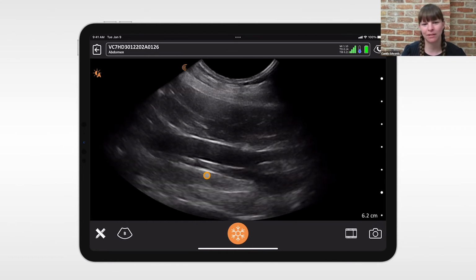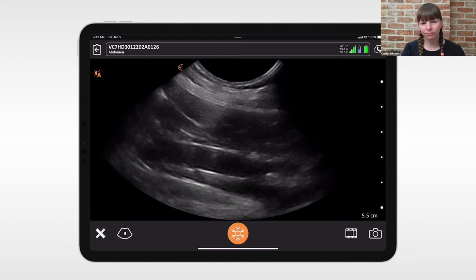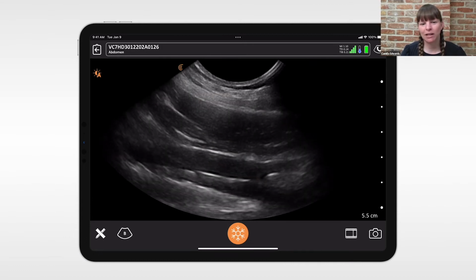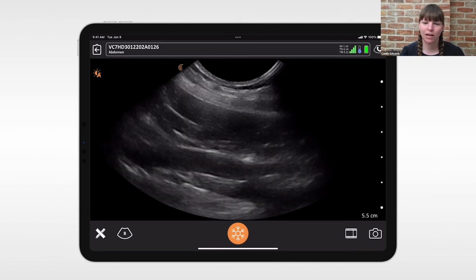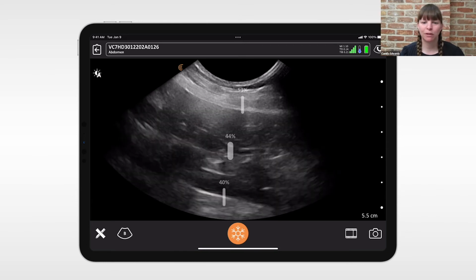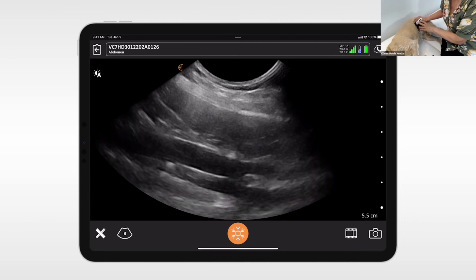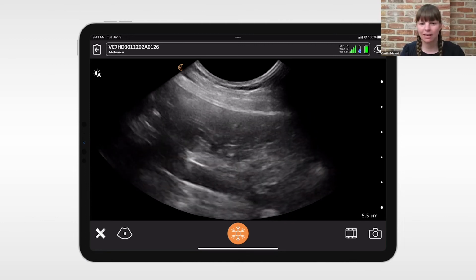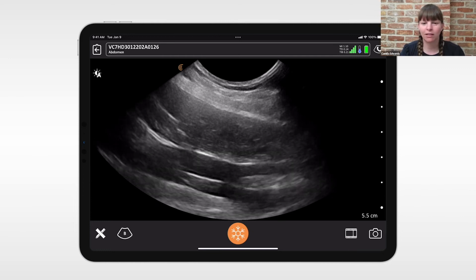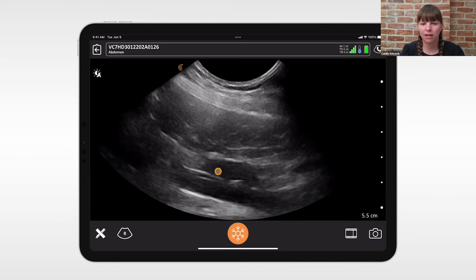Yeah, absolutely. If you're scanning from the other side, the caudal vena cava would be closest. All right, so you've got really nice, you can see the aorta and you can see the external iliac artery there. If you can move the probe a little bit further caudal, so you're getting that aortic trifurcation in the center of the image, that's great. Because that really brings into the center the area we're looking at. And I can already see a little hypoechoic structure, not right up against the external iliac here, but just slightly right here.